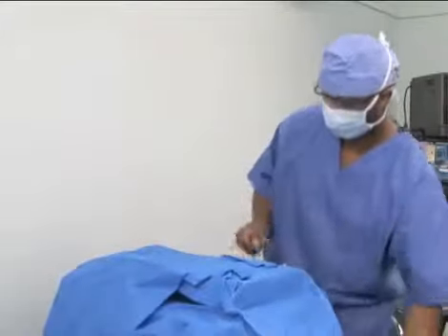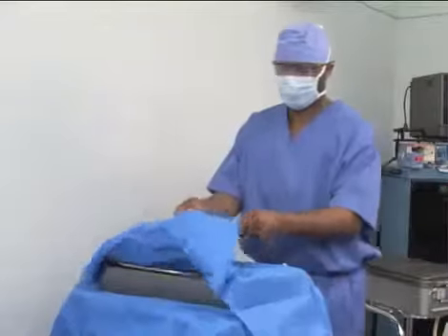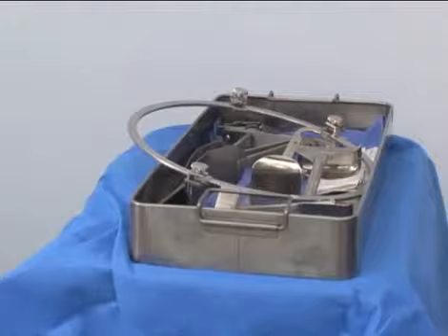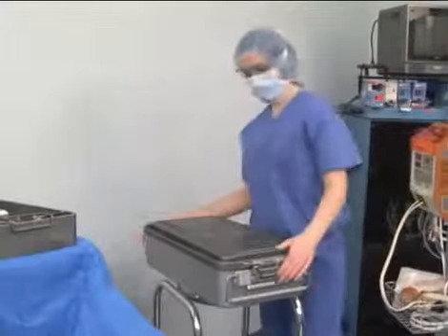Open each side flap. Open the flap closest to the body last, pulling it towards you. This prevents the non-sterile arm from reaching across the sterile surface inside the pack. As sterile items are opened, use more tables if necessary.